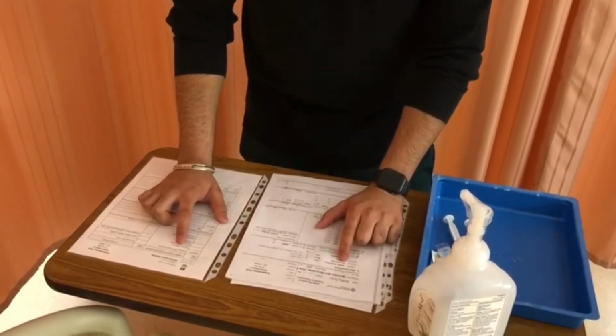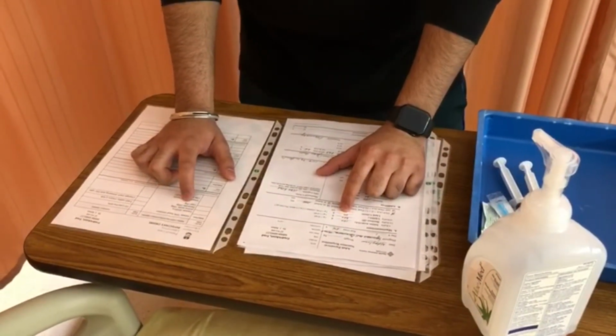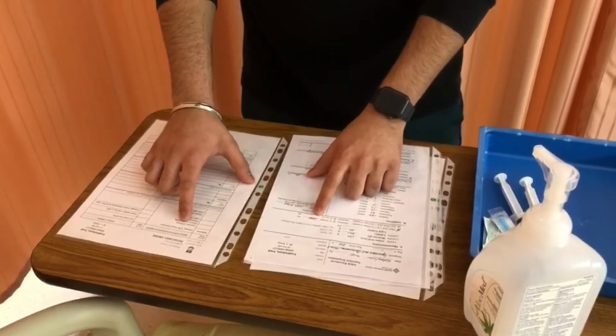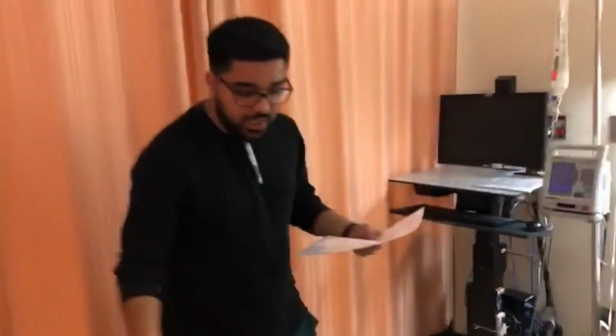We can compare that we have the correct amino acids, so 100 grams, 200 grams of dextrose, and lipids is 50 grams, and our overall is 2,000 mLs of the solution here. So these are compared. Now what we can do is compare our requisition to our actual bag. So this is all part of our first check.